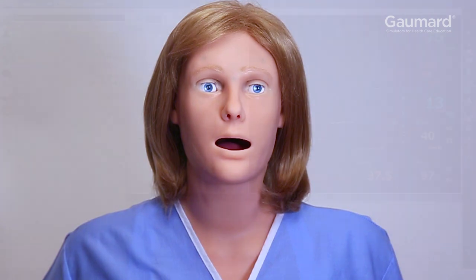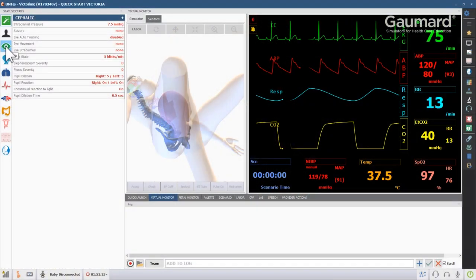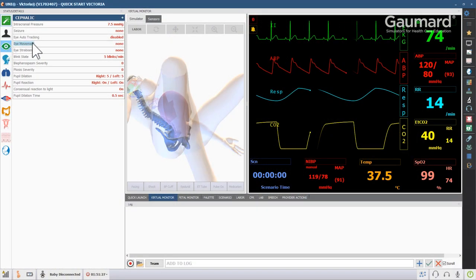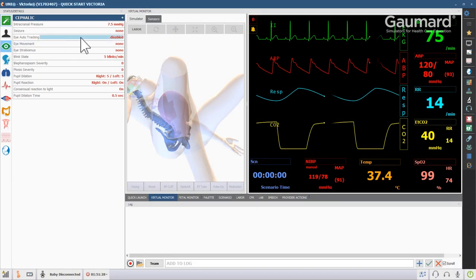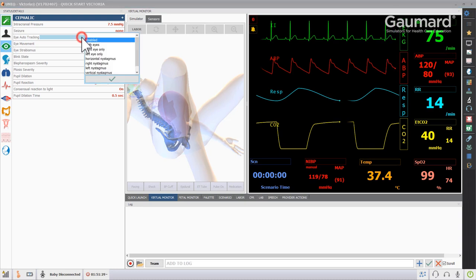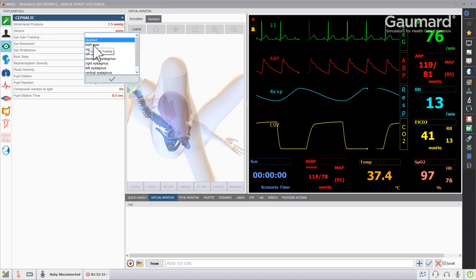Before activating the automatic tracking feature, ensure no hair or other objects are within 4 feet of Victoria's eyes and forehead. To enable automatic eye tracking, click the value next to Eye Auto Tracking, then click Both Eyes.